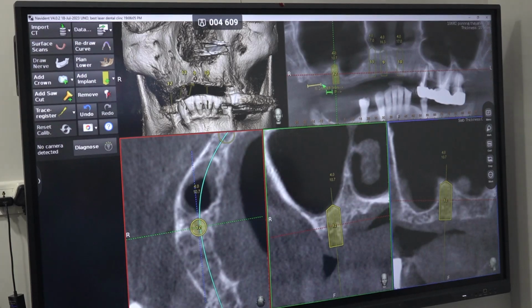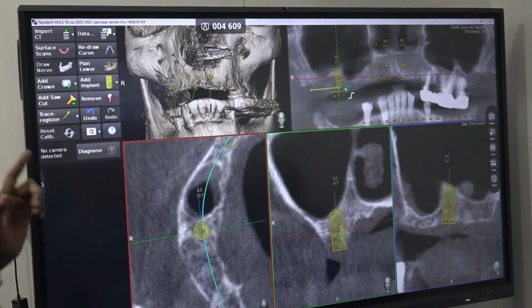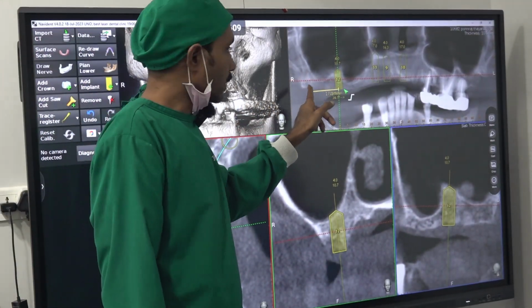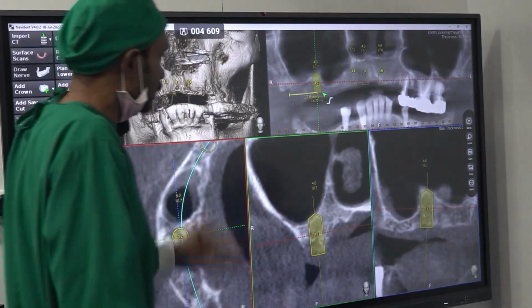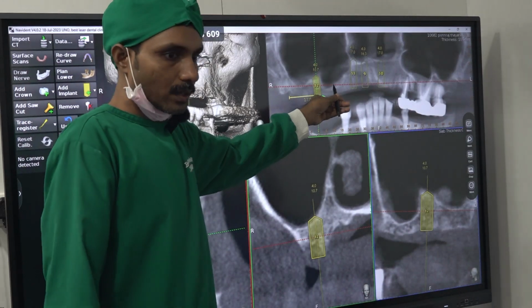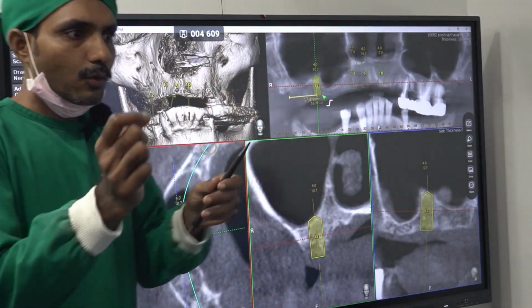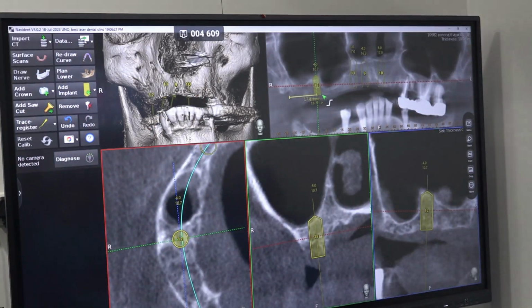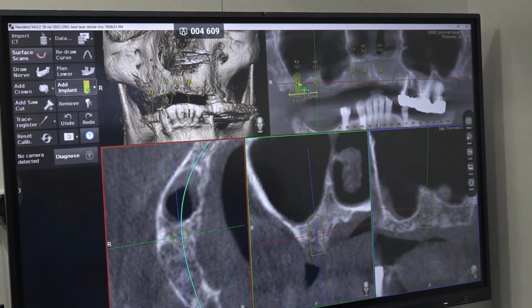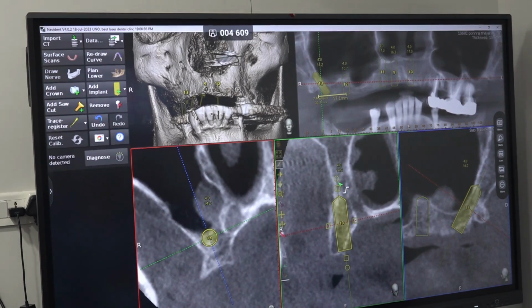From here, it is around maybe 17 mm from the notch. For prosthetics, we'll be using a notch, no? Border molding. From there, it is around 17 mm. You can drill and check. Okay. If you do drilling here, you will immediately enter the sinus. Then we can do the drilling by poking somewhere. No, you can find out the right spot. So this is one option we are keeping. And the important implant is the pterygoid implant.